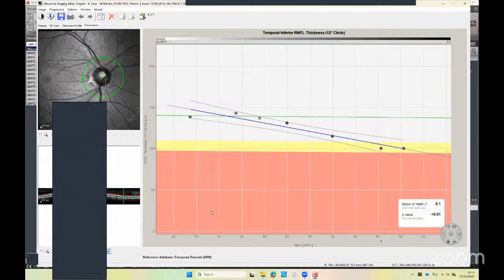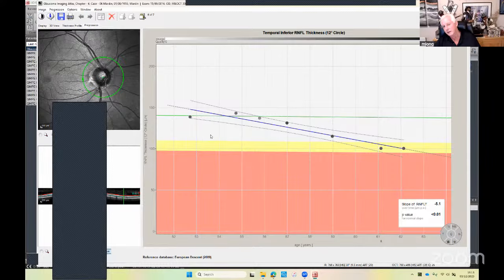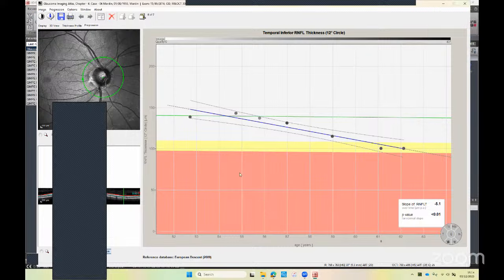Just to understand a little better, when you have the RNFL, when will you say that there is a significant change, that we have to say, okay, there is a significant progression? Yeah, I think commonly it's when you see at least 2, and depending how conservative you are, 3 subsequent deteriorations or loss of tissue. At that point, you might decide clinically maybe we should think about it. But that's your decision as clinician. How many microns do you feel is significant for us to say that there is a possible progression?